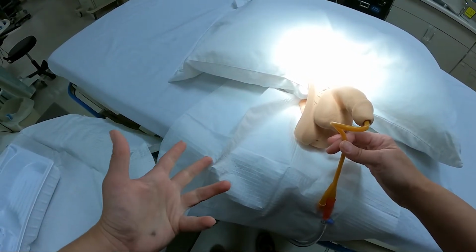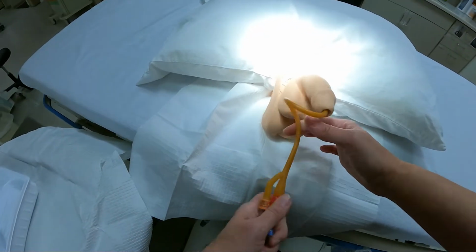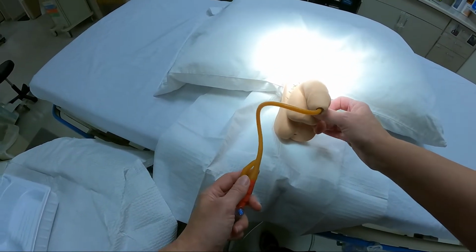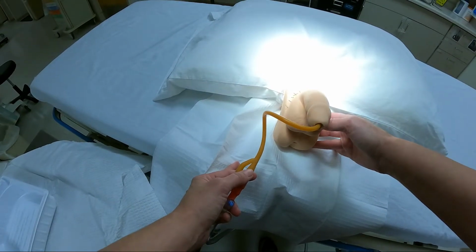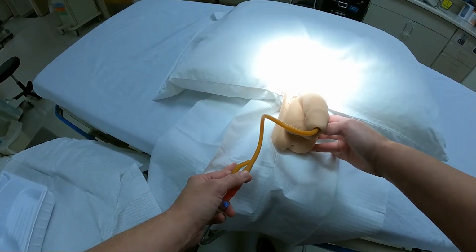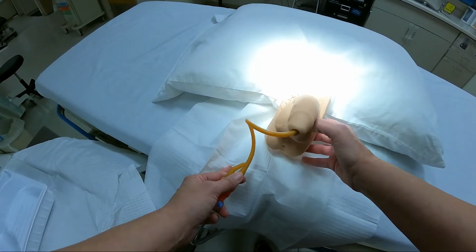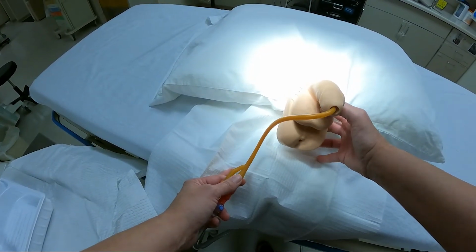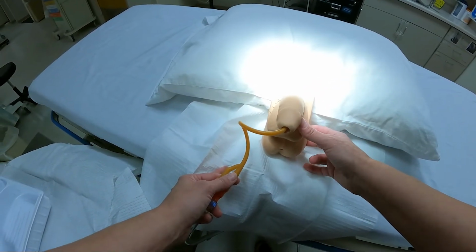Urine sent to the lab, same. So StatLock, put it on, and you make sure that you give them enough. You want enough give in the thing, so if they put their legs straight, they don't yank their catheter out. And they need to be able to move around and walk without feeling like they're going to lose their manhood.